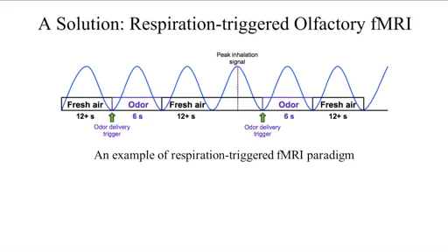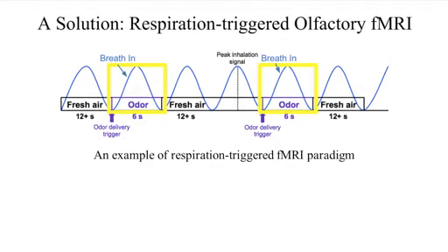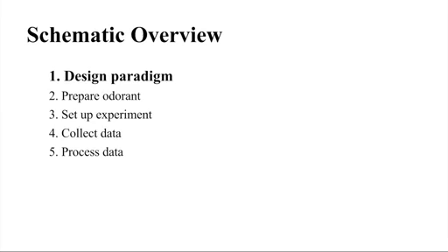A solution to this problem is to set up a respiration-triggered olfactory fMRI paradigm. Effective olfactory fMRI data collection is accomplished by first designing an event-related respiration-triggered olfactory stimulation paradigm on the olfactometer that is resistant to habituation and inconsistent inhalation patterns.